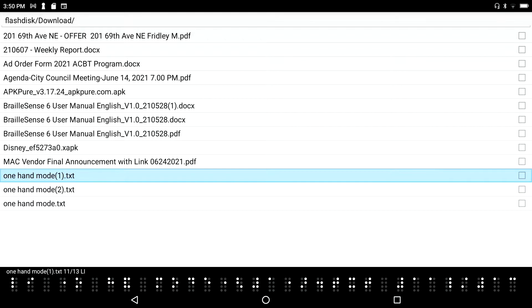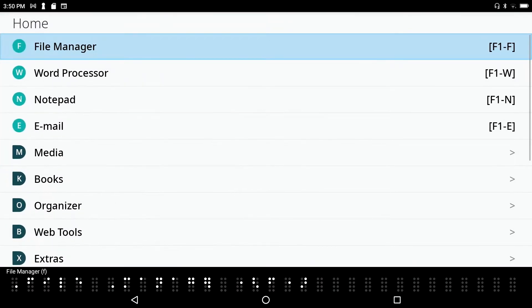For the purposes of this demonstration, I'm just going to send a simple document. And I'm going to start from within my email client. So right from the main menu where I am now, I'm going to press the letter E.